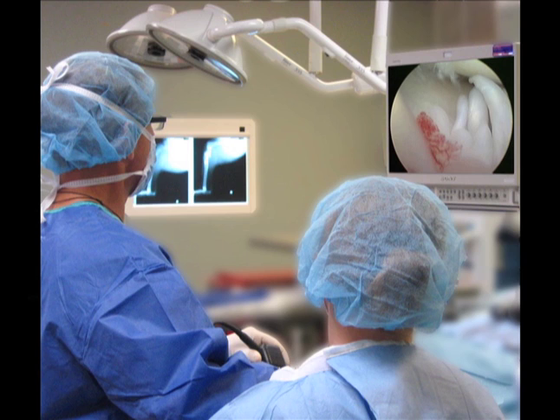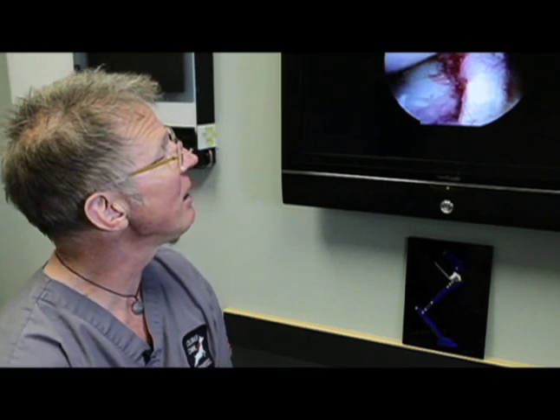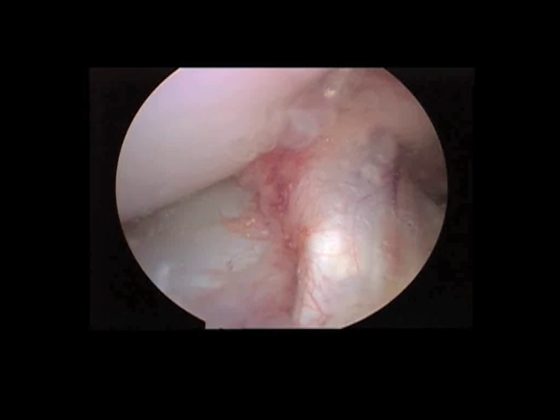Arthroscopy involves a small poke hole and then a scope inserted into the joint, and then a view on the TV monitor to inspect all the structures in the joint, make 100% sure of our diagnosis, make sure there's no meniscal pathology, and evaluate the overall cartilage health for osteoarthritis at that point. And I have several arthroscopic videos to show.